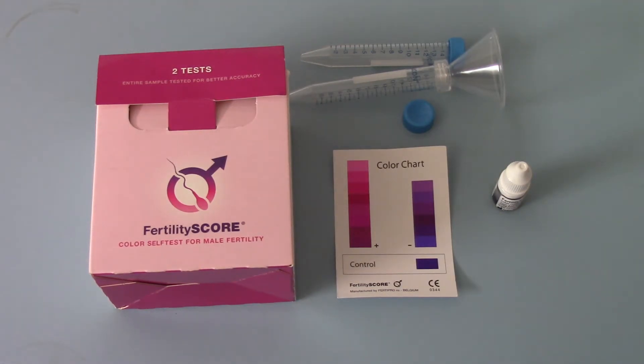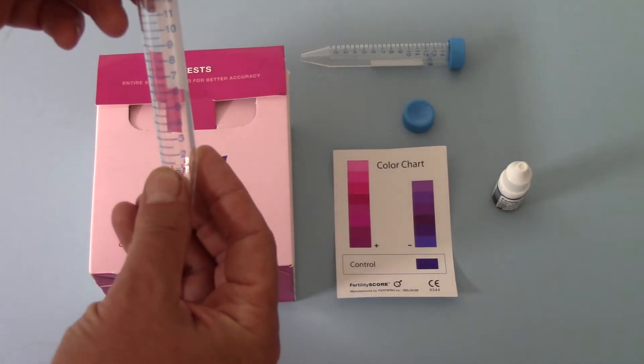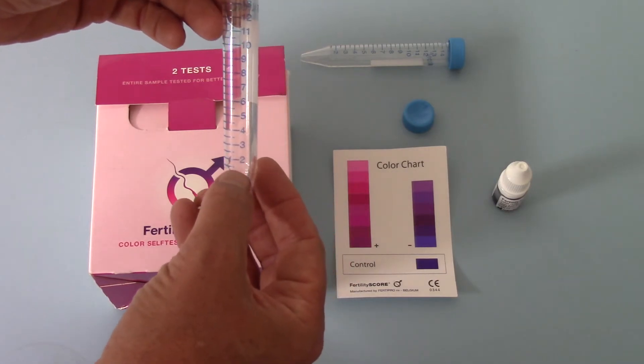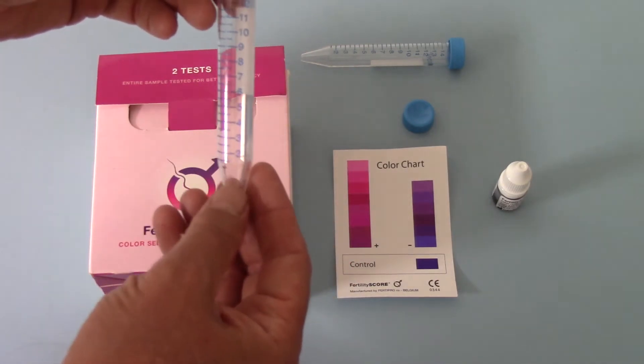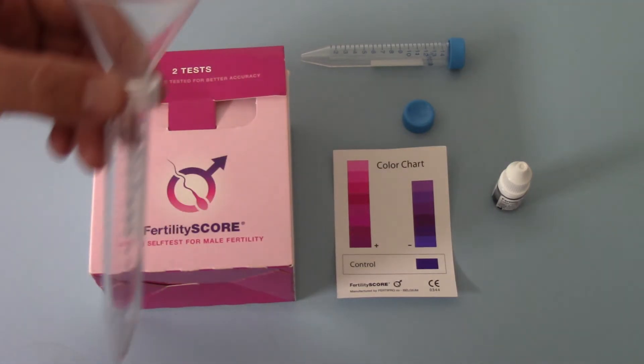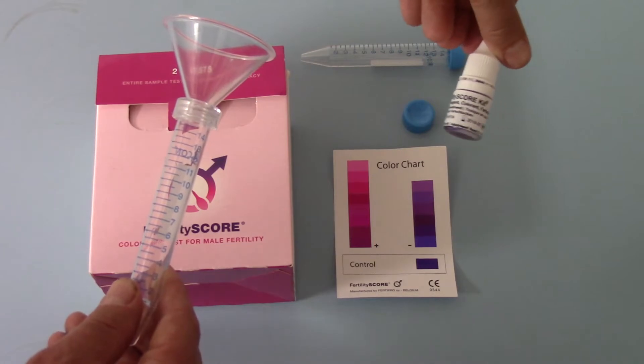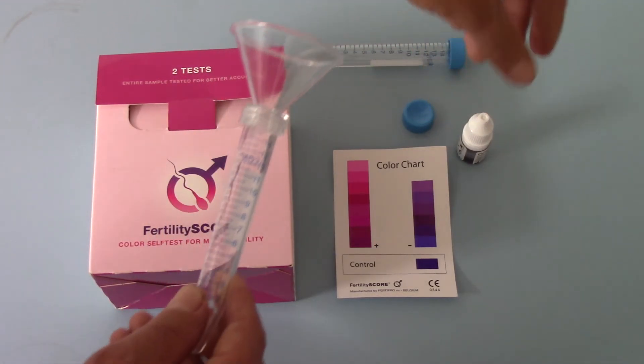This test kit comes with everything you need to complete two tests. The simple instructions are basically: you ejaculate into one of these funnels, and depending on the volume of the ejaculate — two, three, four, five or whatever mils — after 30 minutes you then add the corresponding number of drops of the blue dye, which is supplied in adequate volume for two tests in all cases.